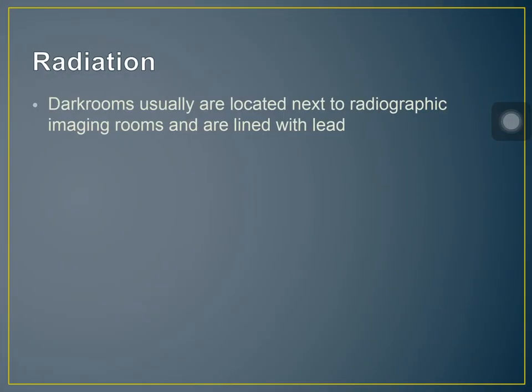Next is dark rooms. Dark rooms usually are located next to radiographic imaging rooms and are lined with lead. So, an exposure to ionizing radiation increases fog and reduces contrast. Yung tinatawag nating radiation fog. Bakit po magre-reduce ng contrast? Fog gives unwanted density on your radiograph, and this unwanted density will reduce your contrast.